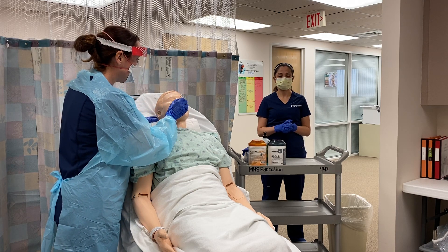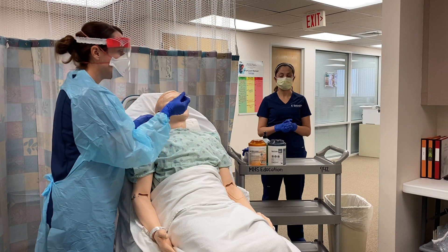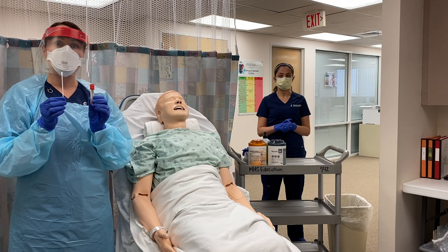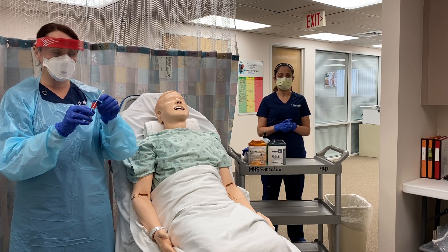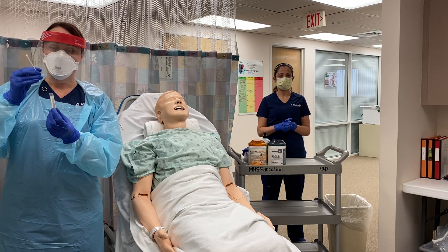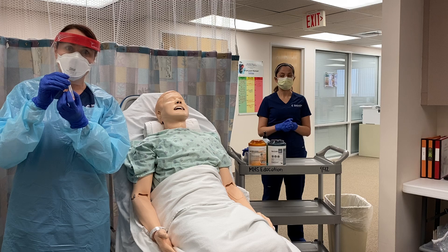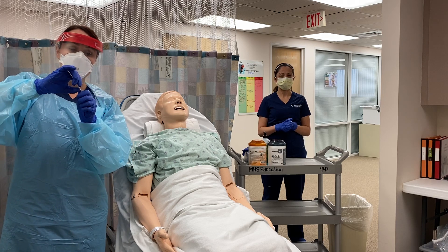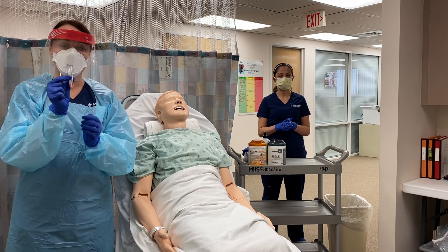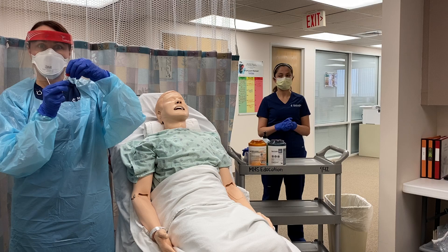After 10 seconds have passed, you're going to gently pull the swab out while still continuing to rotate slightly. Now take your swab and place it in your vial of viral transport medium. Take the cap off, insert the swab making sure it is completely submerged in the viral transport medium, and then break your swab off at the red line — that should be the break point. Now your swab is in the vial; take your cap and make sure it's closed very tightly.